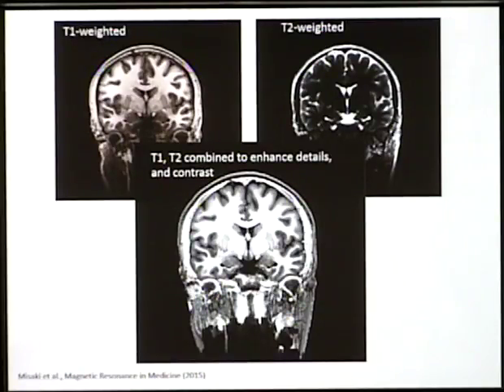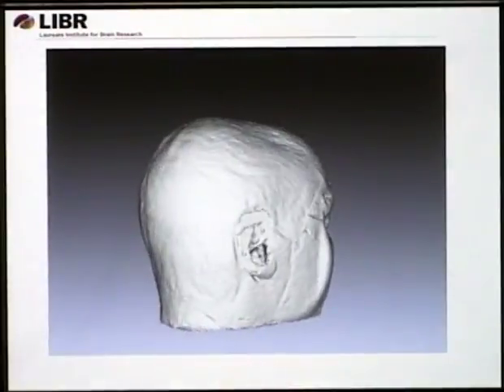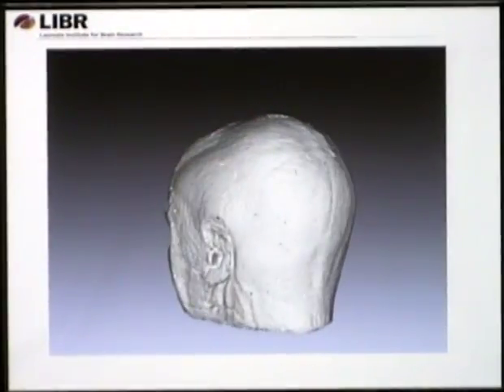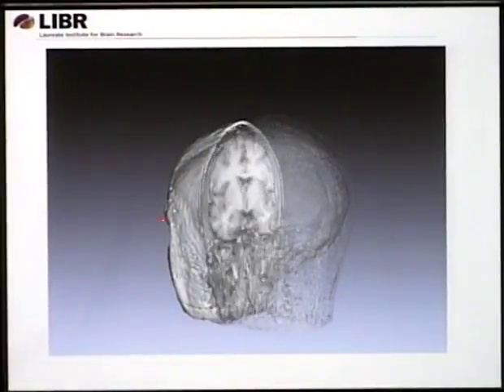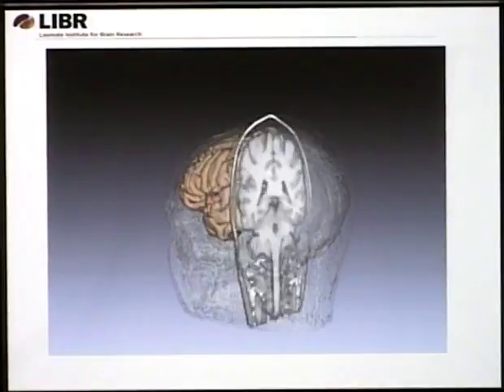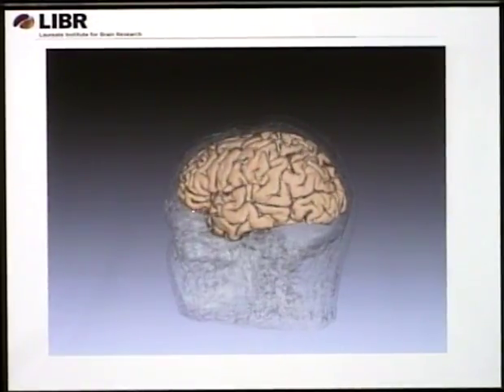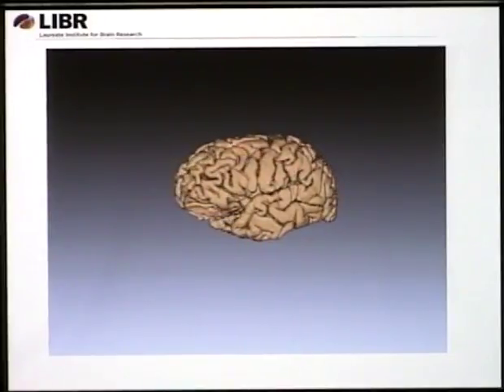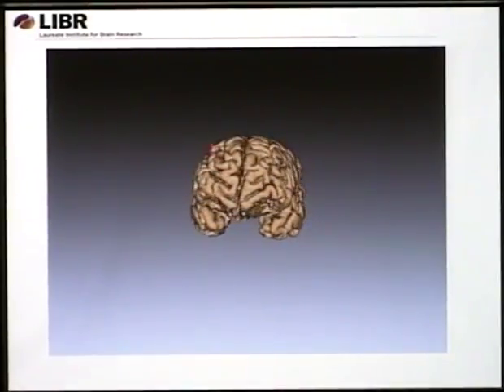But also, once we have the data, we can do things like this. We can do, for example, a rendering. We already collect whole brain information in 10 minutes, and now in the computer we can do things like that. It's not really to show you how fancy this is, but this is actually a very useful technique, especially for the analysis of functional data.